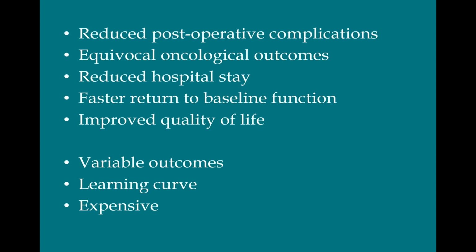And although robotic surgery is becoming increasingly popular among surgeons, I must add a word of caution. The units who've published their data, who have had really outstanding results, have been doing robotic surgery for 10, 15 years, really since the inception of this type of surgery. And so they've got excellent experience, which they've improved year after year with now thousands of cases under their belt. And those results are not replicable everywhere. There is a very, very steep learning curve for this operation.